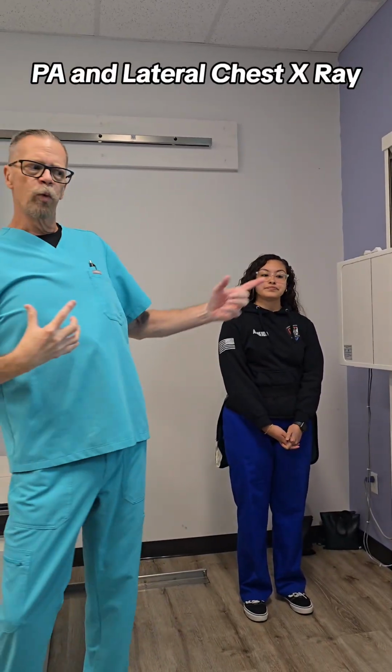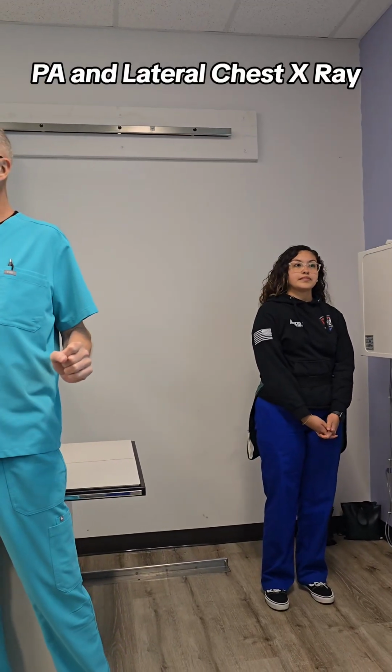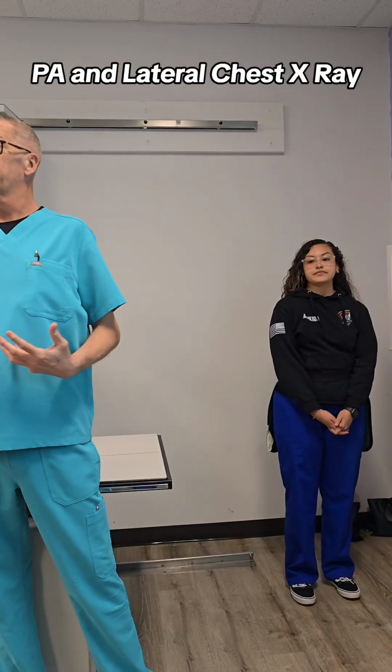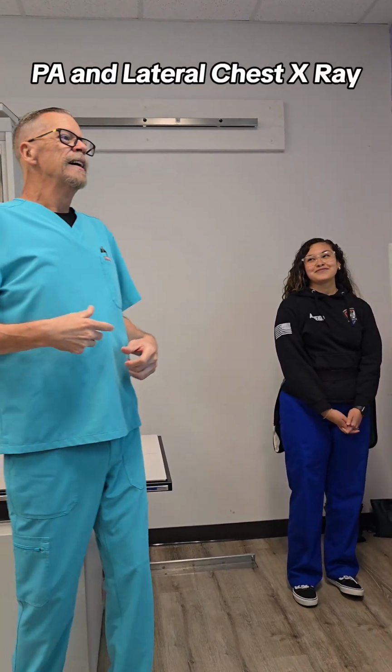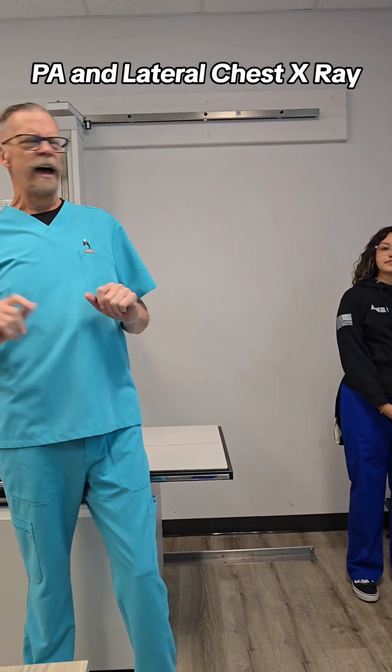So does that mean we want to do chest as a PA or an AP? PA, because the heart is more anterior, not posterior. If the heart was posterior, that would be another weird pathology that we would freak out with.